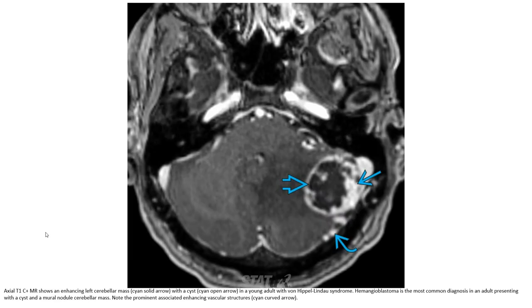On axial T1C+, an enhancing left cerebellar mass is shown in a young adult with Von Hippel-Lindau syndrome. Hemangioblastoma is the most common diagnosis in adults presenting with a cyst and mural nodule. Note the prominent associated flow voids representing the vascular structure.